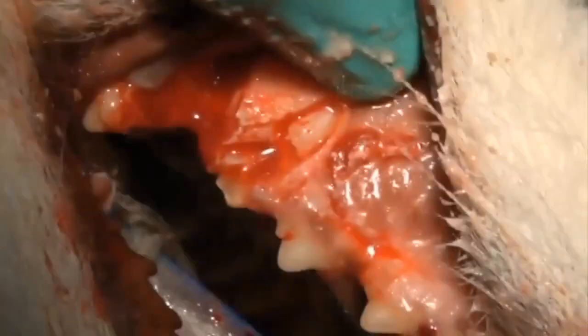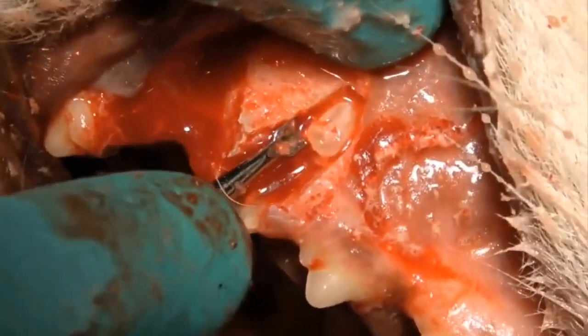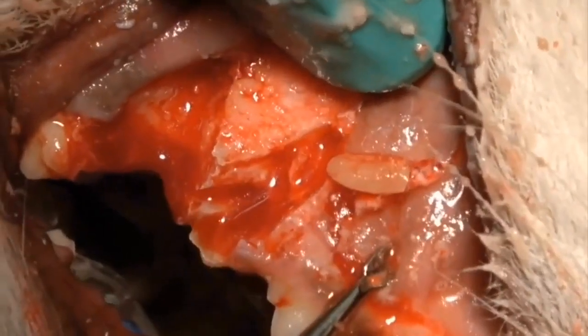This is really easy to do in most of the maxillary teeth. Mandibular teeth, you can't get quite to the apex, but you can get close. And there's the final result.